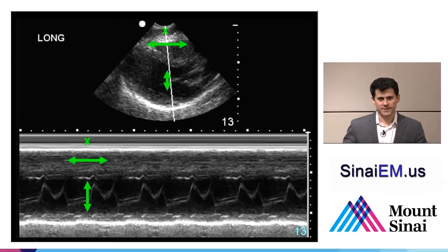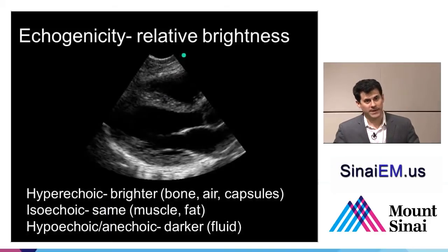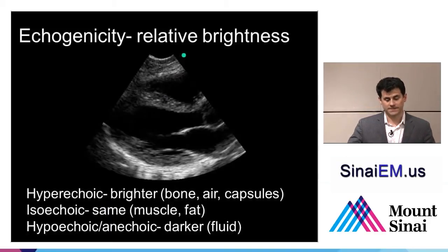I want you to just plant a seed now in your brain to remember what the boring part of M mode looks like, because we're actually going to use it later when we look for pneumothorax in thoracic ultrasound, and it's an incredibly powerful tool. So lack of motion, flat lines up top. Side to side motion, grainy lines. So again, just keep that in mind as we get back to talking about the language of ultrasound.